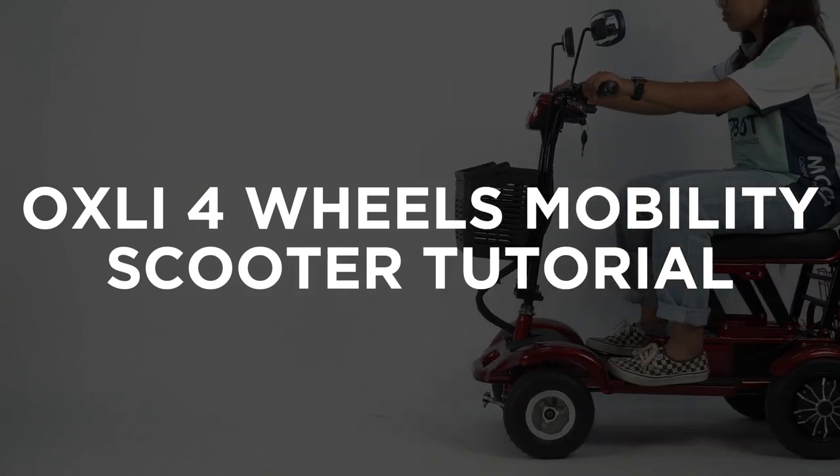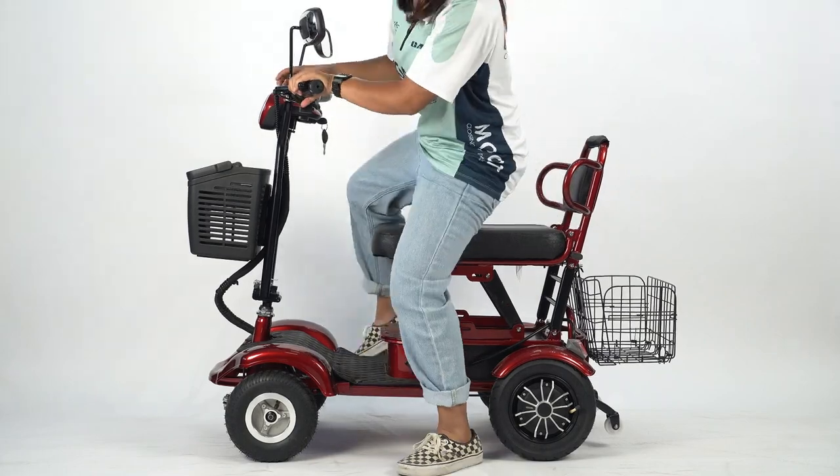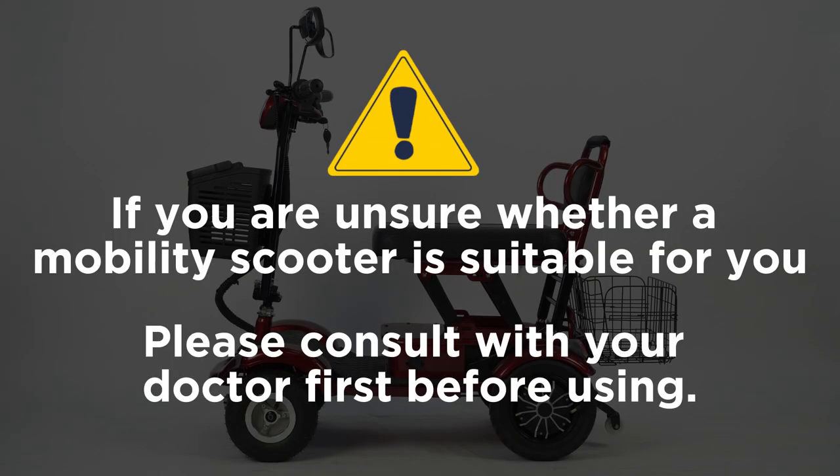This is the tutorial for the Oxli 4 Wheels Mobility Scooter. Before we start this video, if you are unsure whether a mobility scooter is suitable for you, please consult with your doctor first before using.